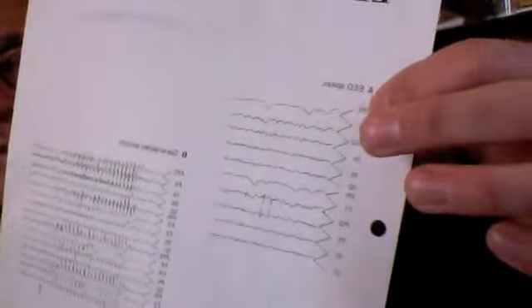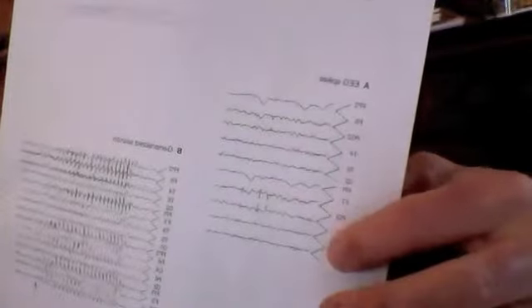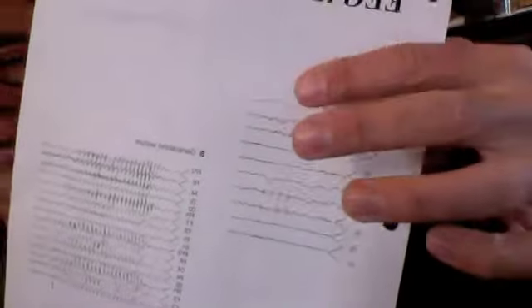So typically, if you see a focal seizure in a particular region, I'm going to give you a little introduction to how this might be viewed. First of all, if you look along here, this shows you the various electrodes that you're recording these waveforms from. F is for frontal and T is for temporal. You'll also see that numbers follow those letters, and the odd numbers refer to electrodes located on the left side of the cerebrum, of the head, and the even ones are from the right side.